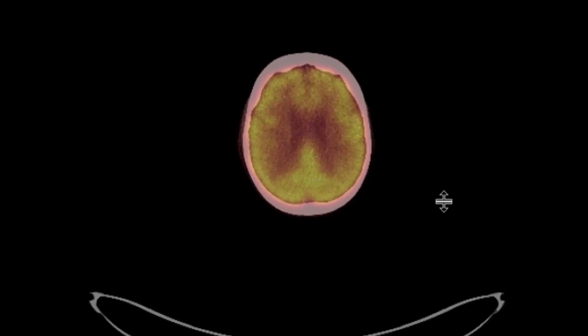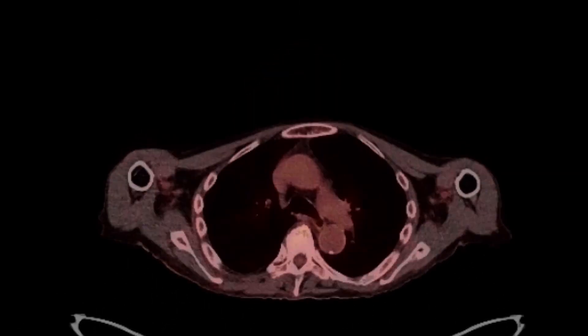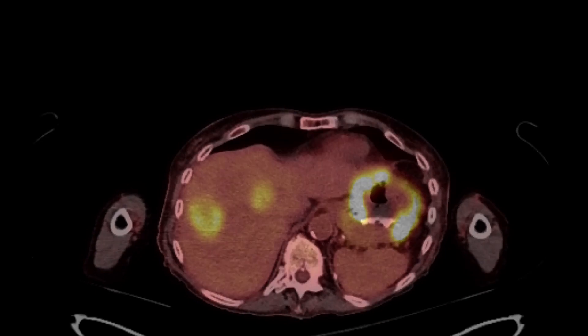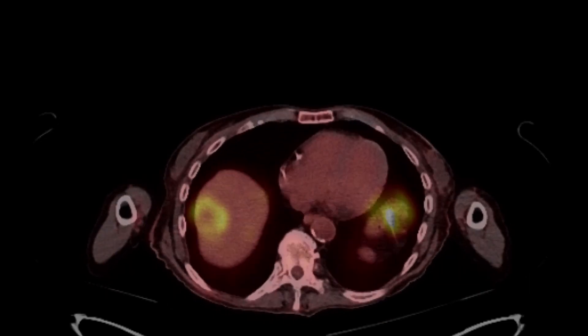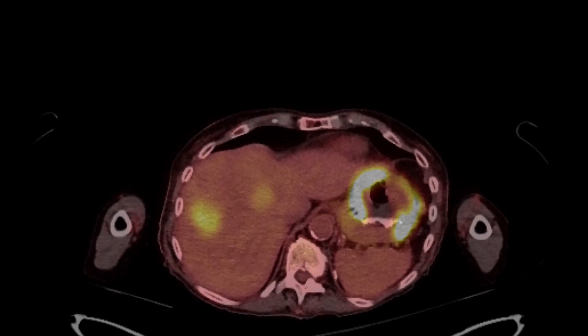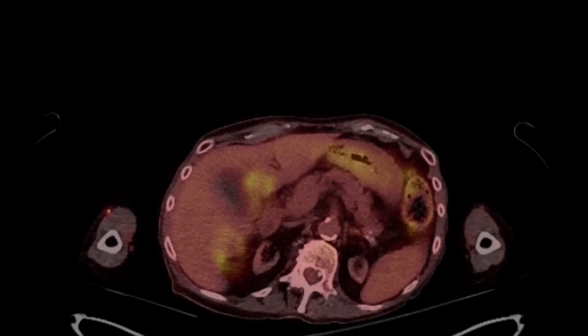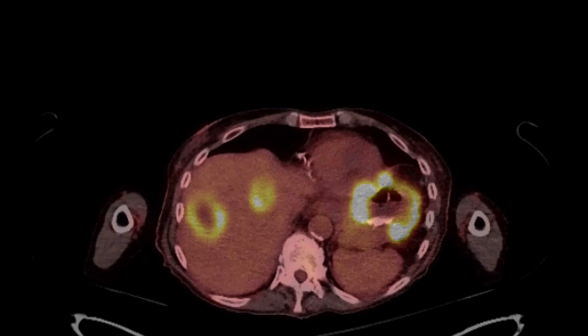The patient happened to get a PET-CT, and we can see on the PET-CT that these findings are all FDG-avid. This was biopsied, and it turned out to be PTLD.